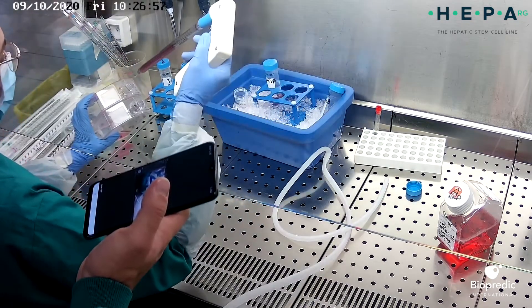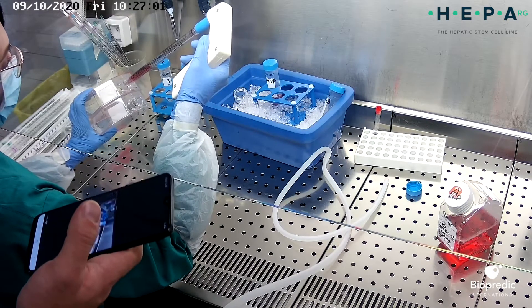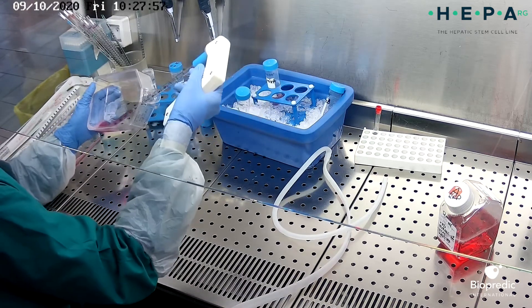To inactivate trypsin, add an appropriate volume of proliferation medium. Pipette the medium over the cell layer surface several times to disperse the cells.